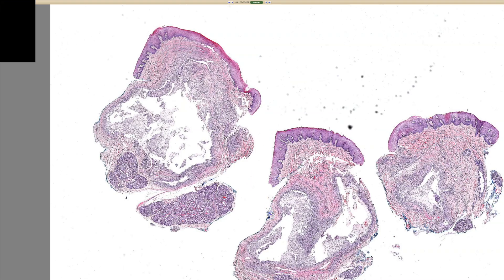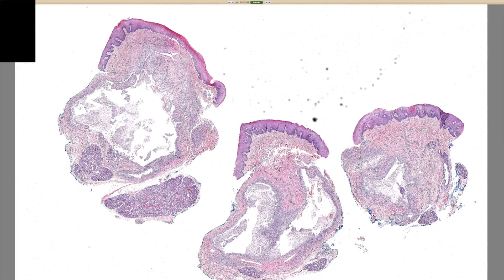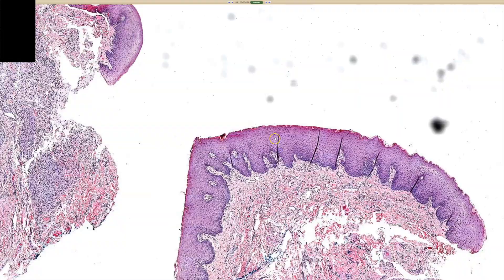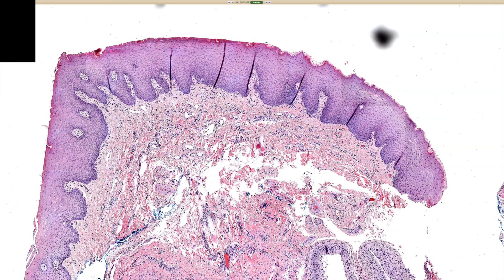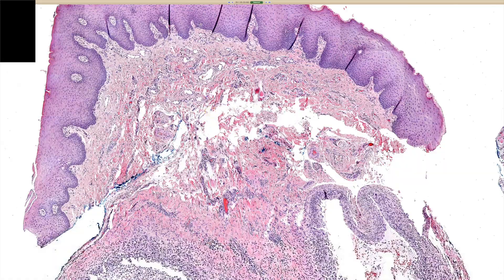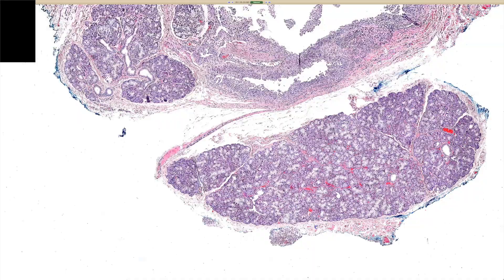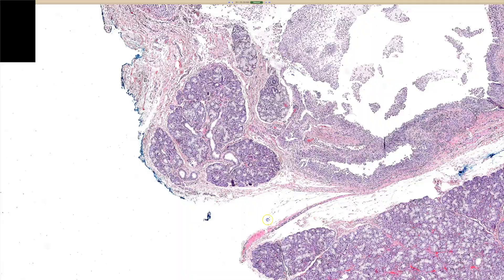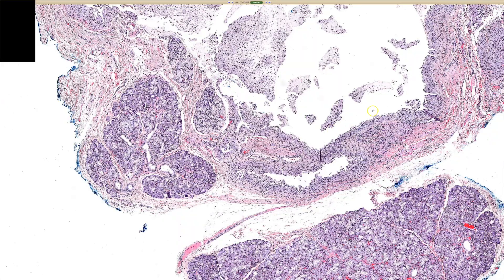For this one, I'm struck by the anatomic site clue. The epidermis looks a little pale, and the corneal and granular layers suggest this might come from the lip or oral mucosa. Supporting that are these almost cauliflower-like structures at the base of the specimen with cleared-out areas that I think are consistent with salivary gland.